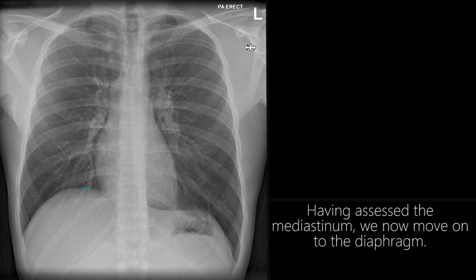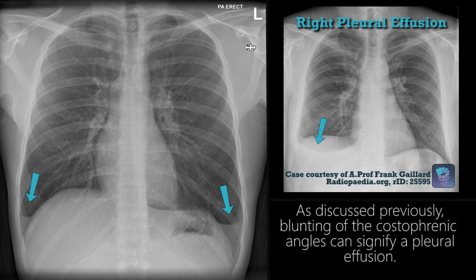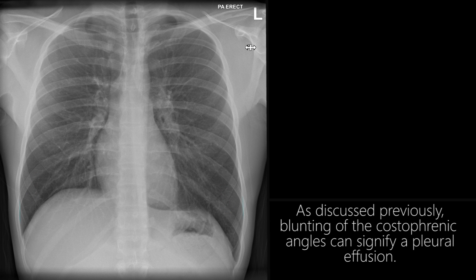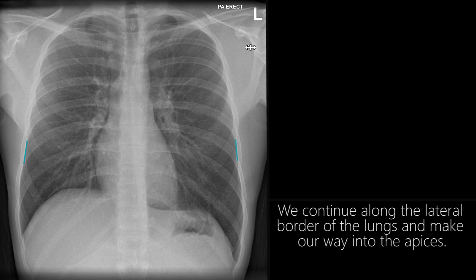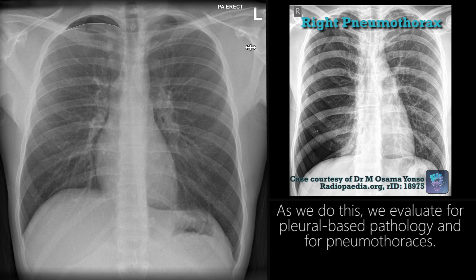Having assessed the mediastinum, we now move on to the diaphragm. Follow the contour of the diaphragm from the cardiophrenic to the costophrenic angles. As discussed previously, blunting of the costophrenic angles can signify a pleural effusion. We continue along the lateral border of the lungs and make our way into the apices, evaluating for pleural pathology and pneumothoraces.